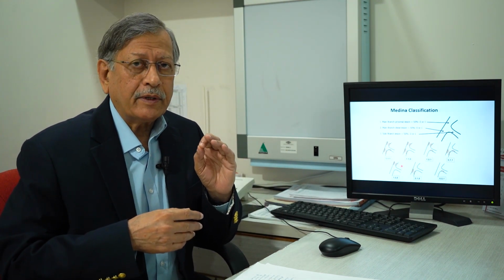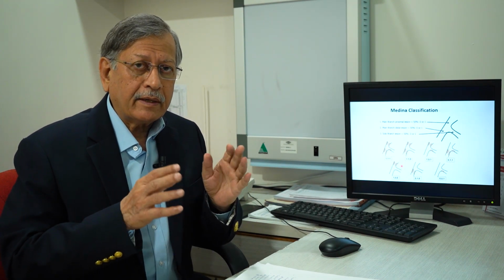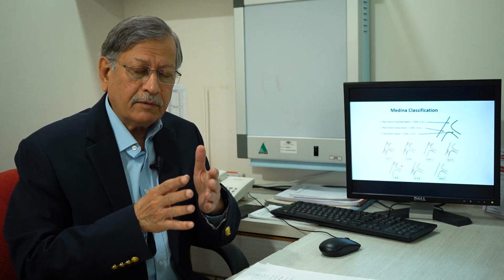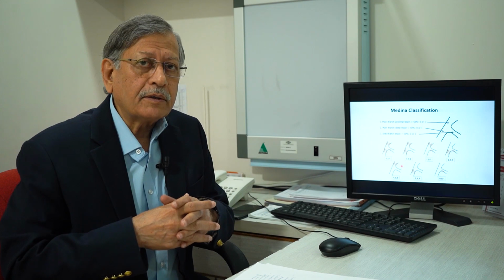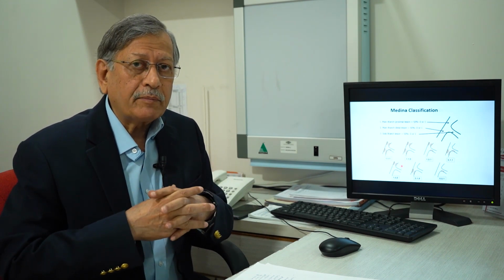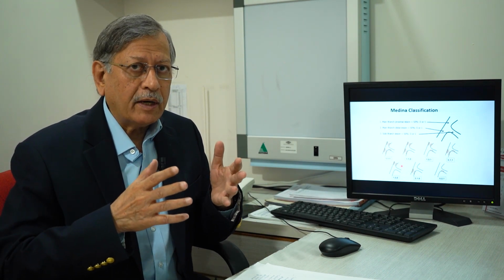And a very important part is that there may be carinal shift. The carina that we have, when you actually balloon it and stent it, may shift and cause occlusion of the side branch. So these are all dynamic changes, and we must keep that in mind.